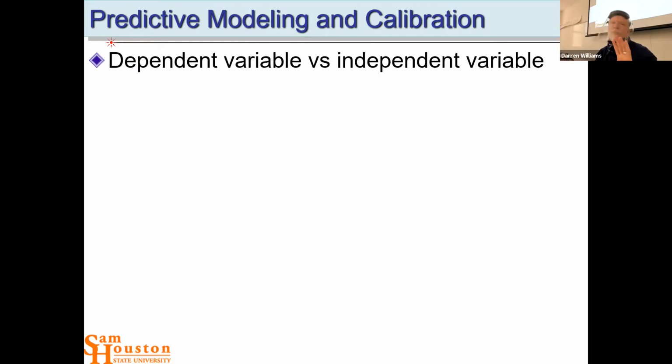and there's a lot of different concentrations or abundances that you could have. But you just always look at the units that you're using and try to understand what that model is calibrating. In today's examples, we're looking at area counts on a chromatogram. And then along the x-axis are independent variables, parts per billion of cocaine.